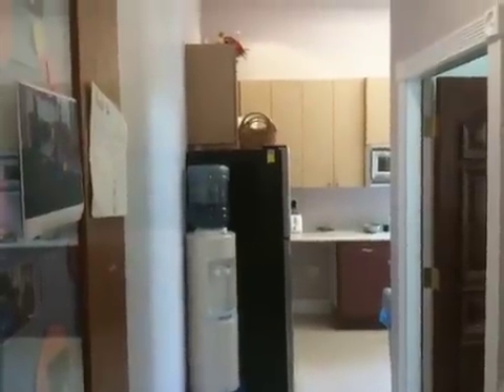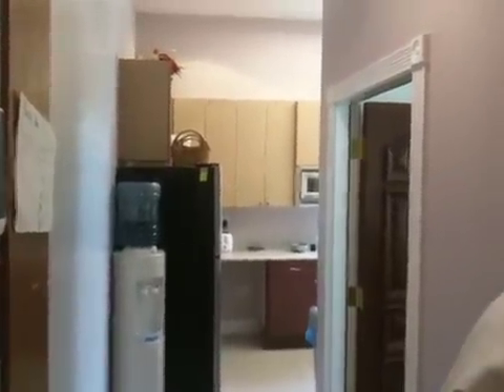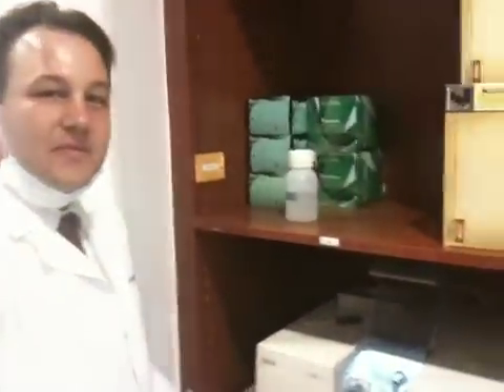Welcome to this video. I'm at the dentist's, and this gentleman here is Dr. Adam Raschke. I'm having a crown put in today, and I was fascinated when I recently had another crown put in and learned about the technology they're using here.